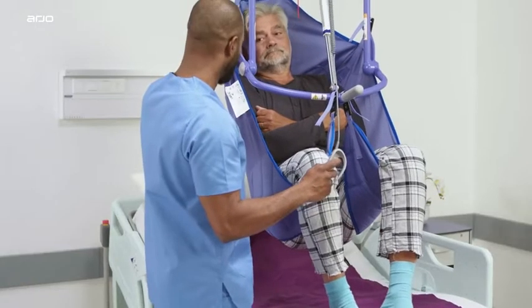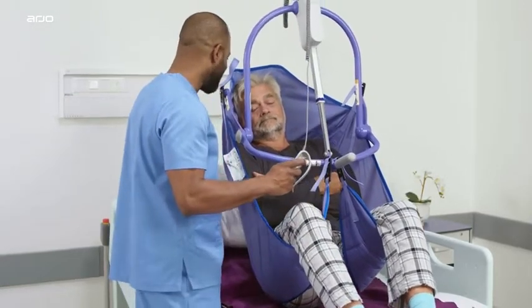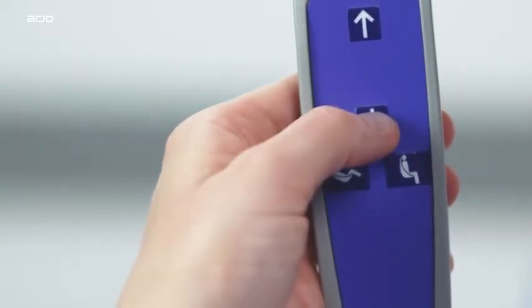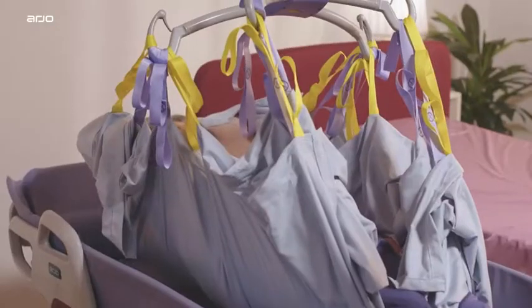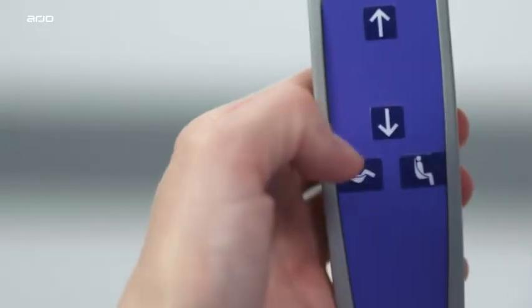The raising and lowering functions accelerate gradually to prevent any abrupt movement as soon as the button is pressed, and remain active for as long as the button is pressed. The movement decelerates gradually to prevent any abrupt movement when the button is released.